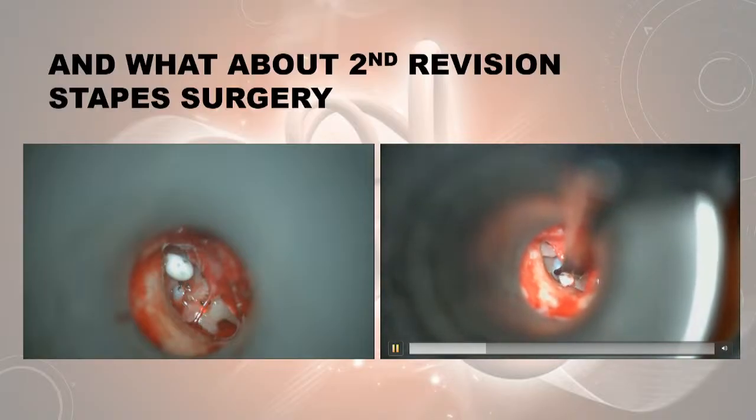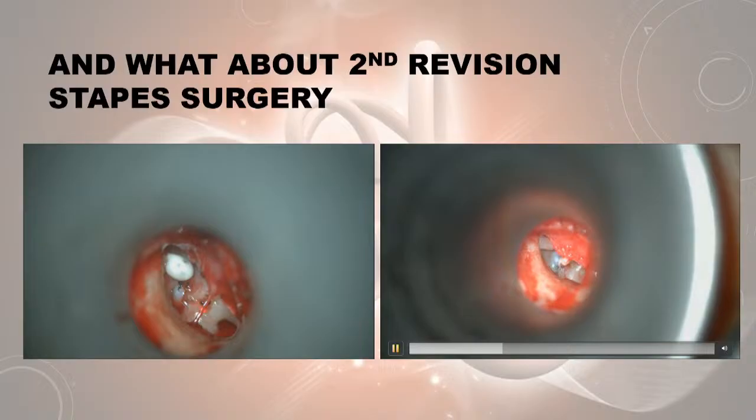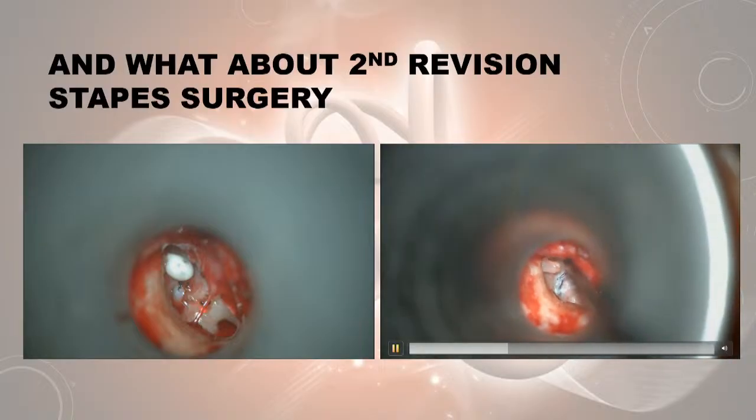So we just gently take that. We're able to remove the cement. Now I know you say, well, that's so easy, then surely the cement will break. Well, somehow they stay. I don't know why, but we're having very consistent results still long term.